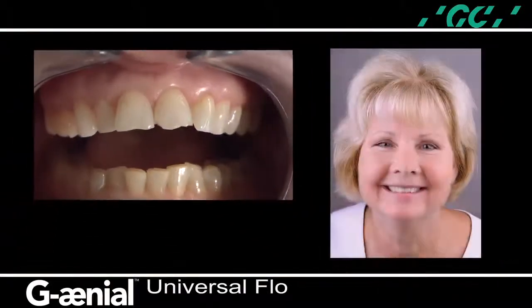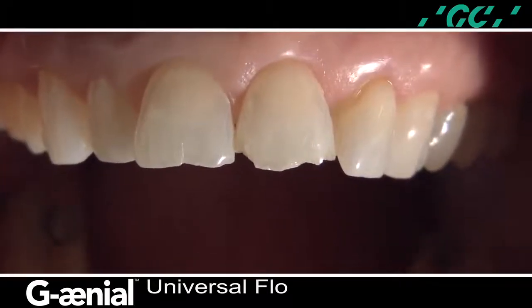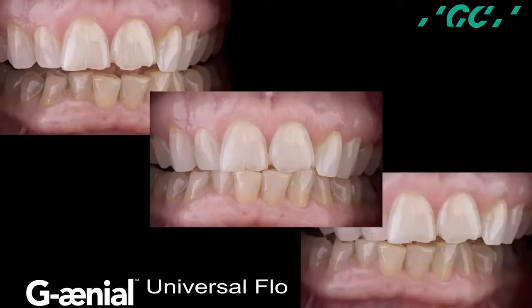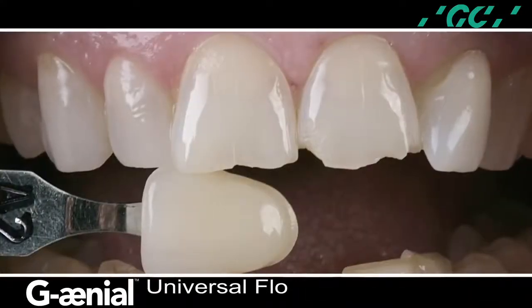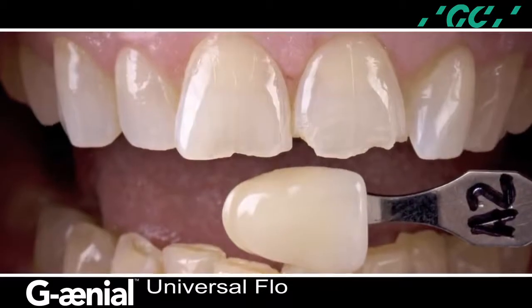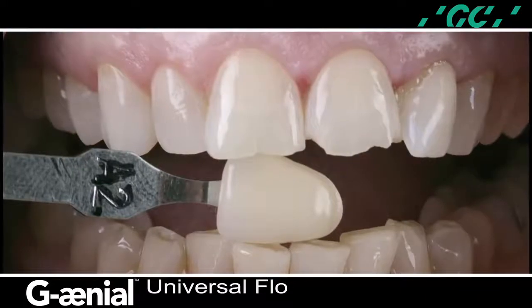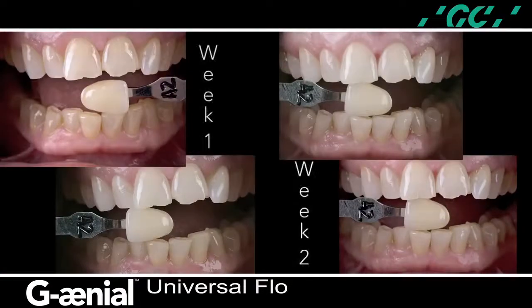A 55-year-old patient presents with incisal fractures on the maxillary central incisors. Upon occlusal evaluation, the occlusal findings indicate an insufficient canine guidance and posterior disclusion. The patient indicated her concerns for the yellow-orange discoloration and requested a brighter smile. An initial shade determination was performed prior to the bleaching procedure. Once the bleaching process was completed, the restorative procedure was delayed for one week to allow for elimination of residual oxygen or peroxide formation in the tooth structure that can reduce the potential bond strengths.